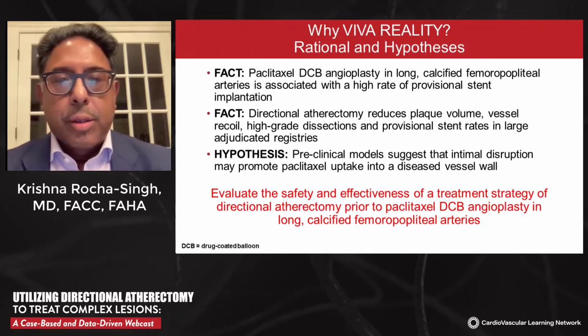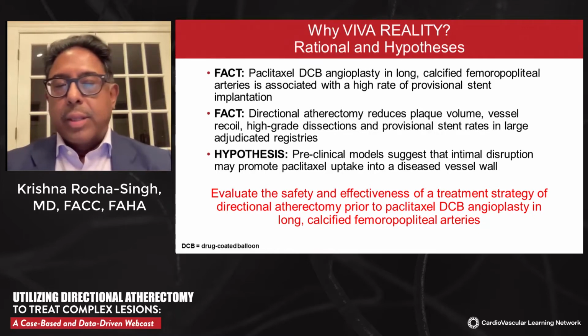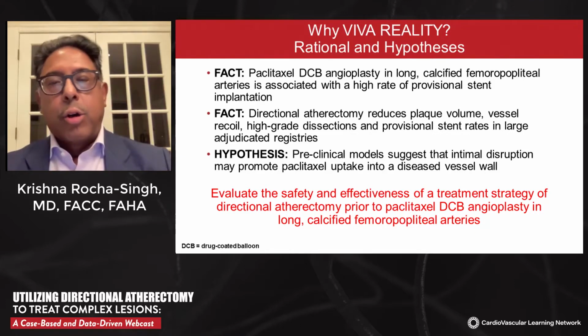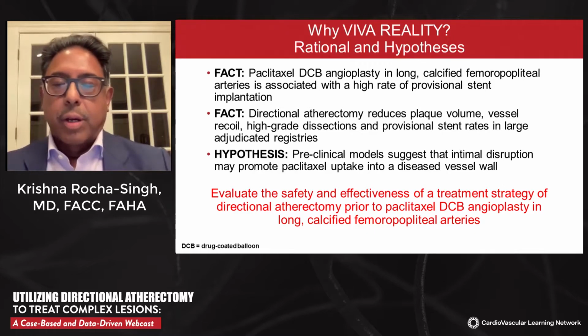As such, the VIVA REALITY trial set out to evaluate the safety and effectiveness of the treatment strategy involving directional atherectomy in these long calcified femoropopliteal lesions prior to the application of the paclitaxel drug.